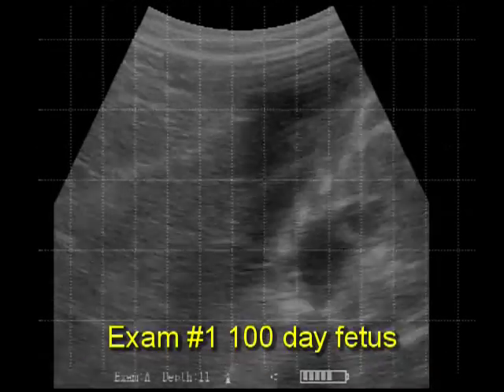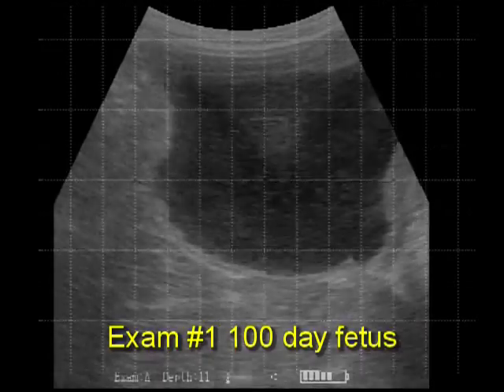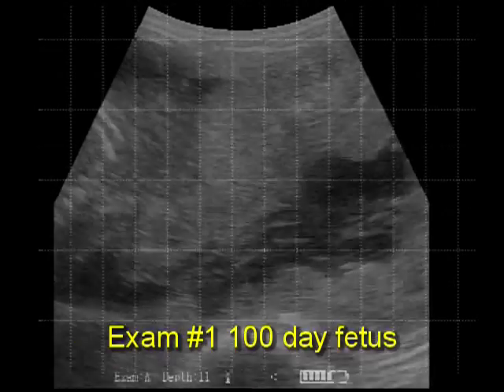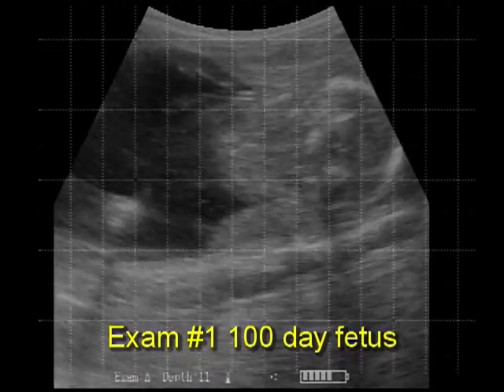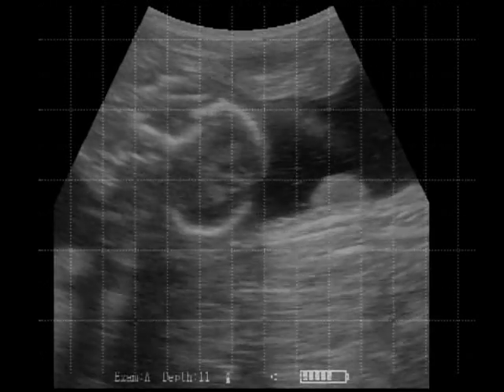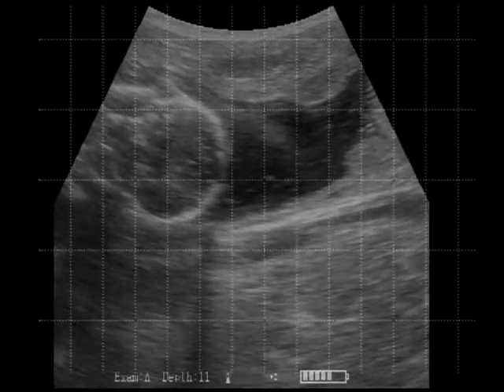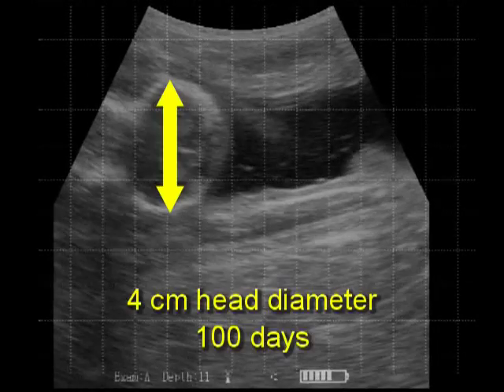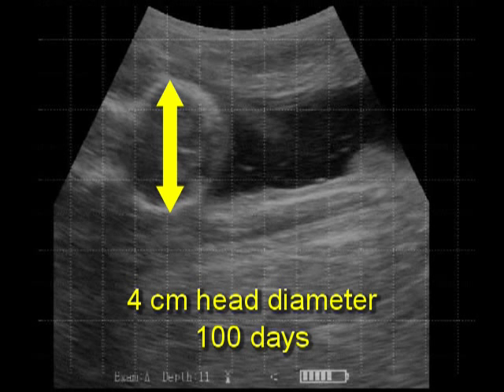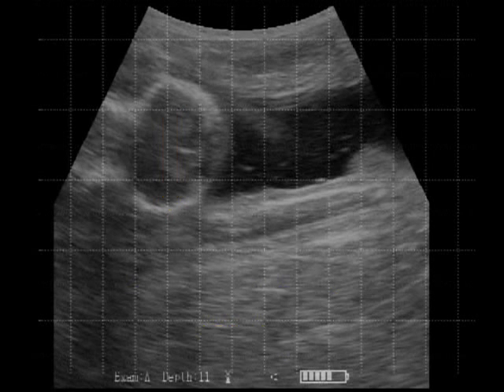Exam 1 is a 100-day fetus. Here we're on the hind end, working the probe towards the head, trying to get the best head diameter — the largest head diameter possible. Here we are at approximately 4 centimeters based on the grid for 100 days.